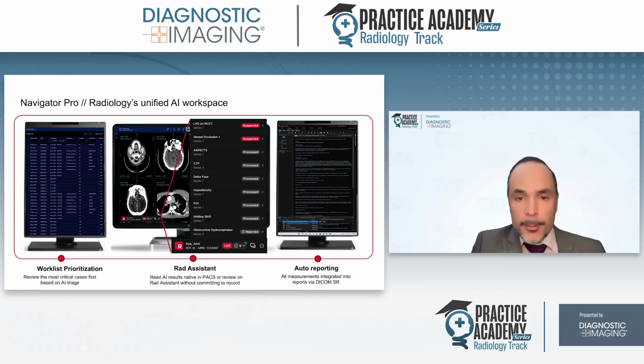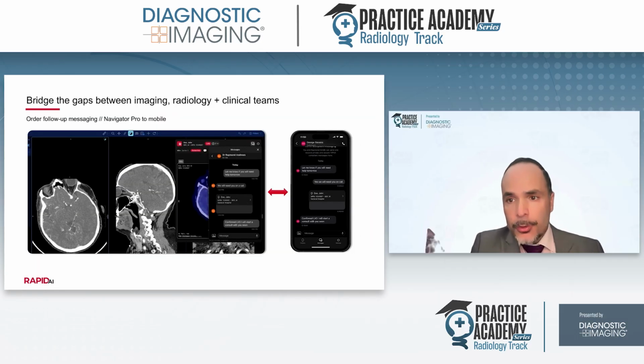Another large part of the burden in standard practice for radiologists is the process of communicating urgent findings when those do arise. You may have clinical coordinators, you may have reading room coordinators, or you may be looking through Epic Chat or through other such tools, but this can be time-consuming.